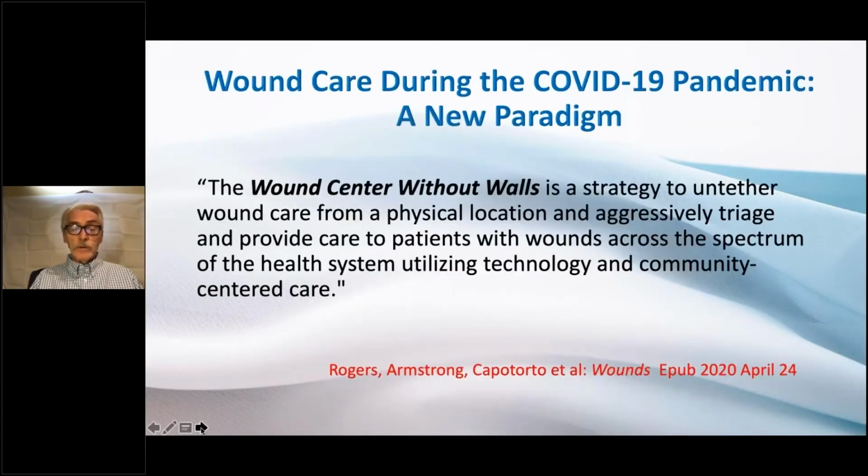This was an interesting paper by my colleague Lee Rogers. It was just published online, and I think it was very appropriate to mention at this point. He's talking about the wound care center without walls, like a hospital without walls. The wound care center without walls is a strategy to untether wound care from a physical location and aggressively triage and provide care to patients with wounds across the entire spectrum of the healthcare system, utilizing technology and community-centered care. Now, how does this come into play with our discussion on topical oxygen?